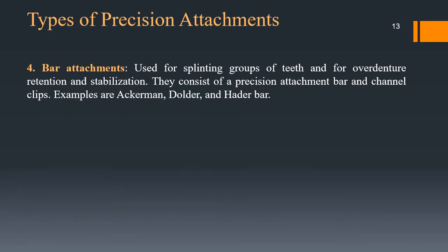Bar attachments we use for splinting of groups of teeth and for overdenture retention and stabilization. They consist of a precision attachment bar and channel clips, and examples include the Ackerman, Dolder and Hader bar.